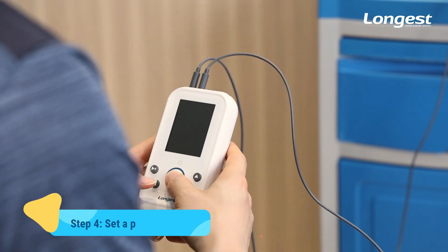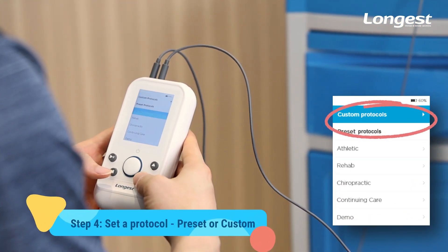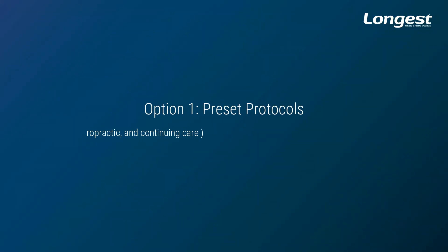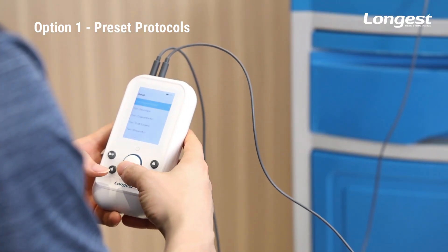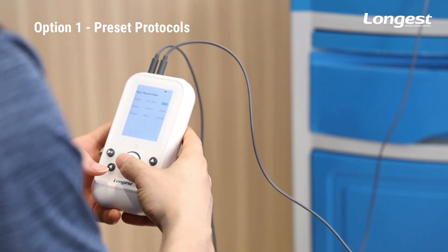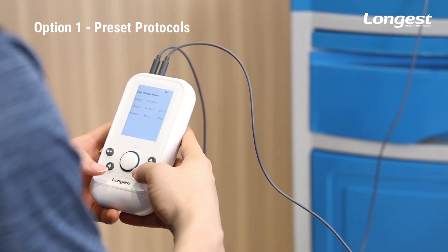Long press the button to turn on the device. There are preset protocols and custom protocols for options. Preset protocols provide you with a fast therapy option — you just need to pick one that suits the patient's condition. Press the button to select, then press the central button to confirm. You will then enter the parameter setting interface.